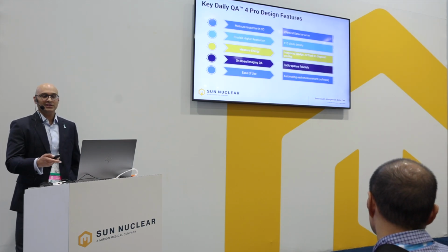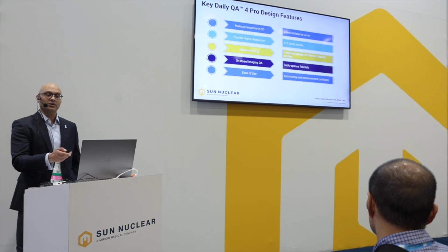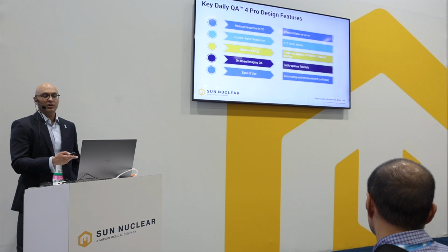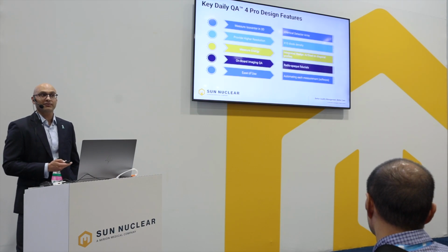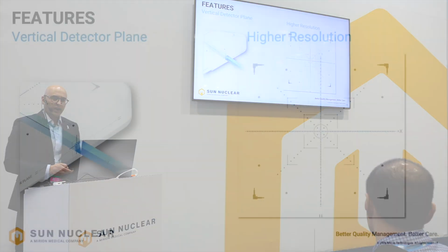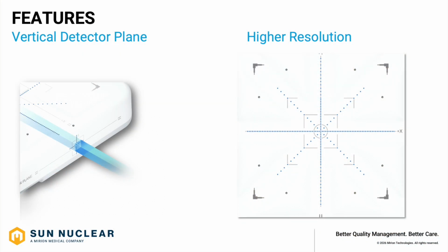And because the software runs in trigger mode, it knows when to transition from one measurement to the next. So you really don't have to interact with the software at all. I have a picture of this later. Yeah, I just wanted to spend a little time highlighting the features.